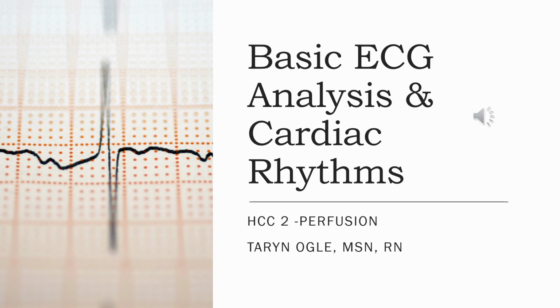Hello, everyone. Today we're going to be looking at a very important skill in nursing, which is ECG analysis and identification of cardiac rhythms. As nurses, you will frequently encounter patients with heart rhythm disturbances, ranging from harmless to life-threatening. So, understanding dysrhythmias is very important for being able to recognize those early warning signs so that we can intervene appropriately and ultimately improve our patients' outcomes.